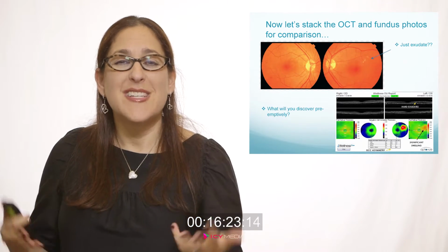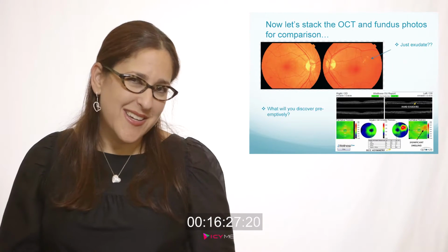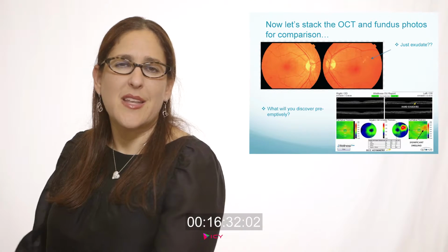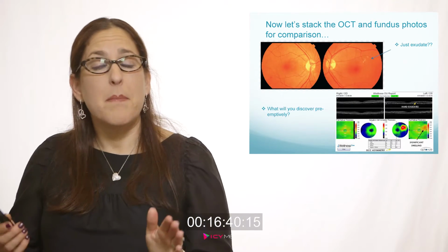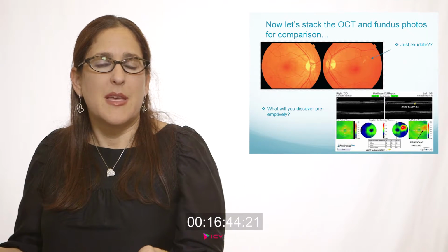And I said before, is it just exudate? Because if I were to look at that picture in clinic, I would say I don't see any swelling. All I see there is exudate. The OCT highlights the swelling or the amount of edema in that area. And it may even lead you down the track of saying, is there diabetic macular edema? Okay, is this affecting the fovea?